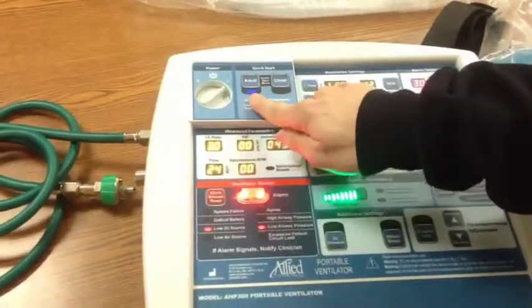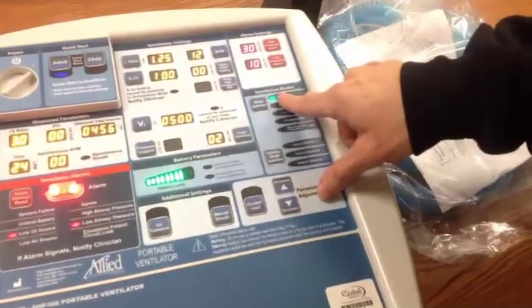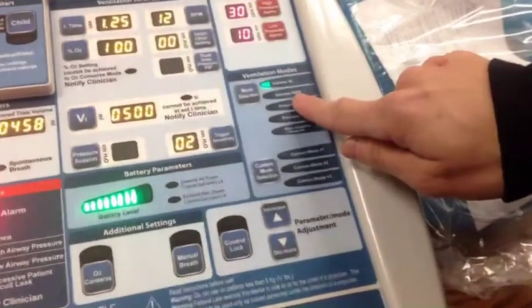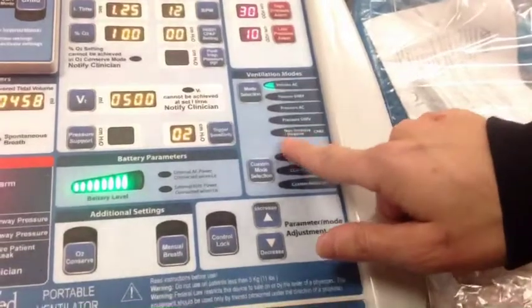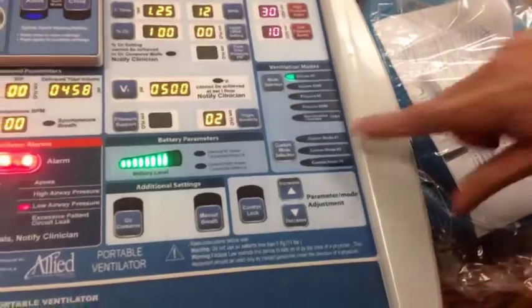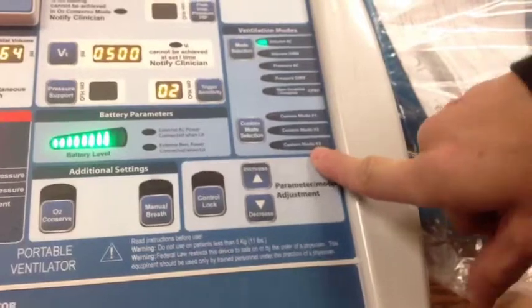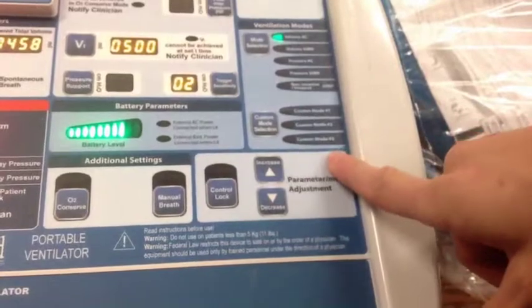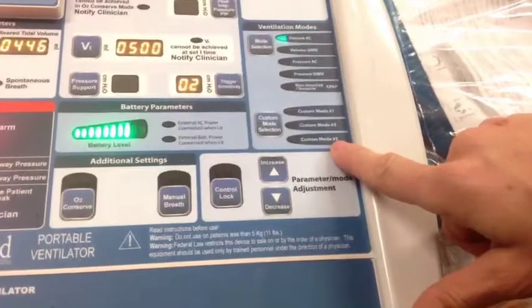Now, we're locked in on adult, and the first ventilation mode, under the ventilation modes here, we're under volume AC, so volume assist control. We have volume SIMV, we have a pressure AC, a pressure SIMV, and a non-invasive CPAP or BiPAP mode. We can also put in custom modes if we have patients that are chronic vent dependent, which we actually do in the project that this is being featured in. So these are programmed for some of our regular patients that we see almost on a daily basis.